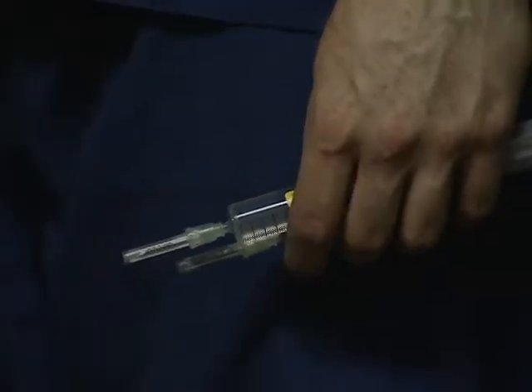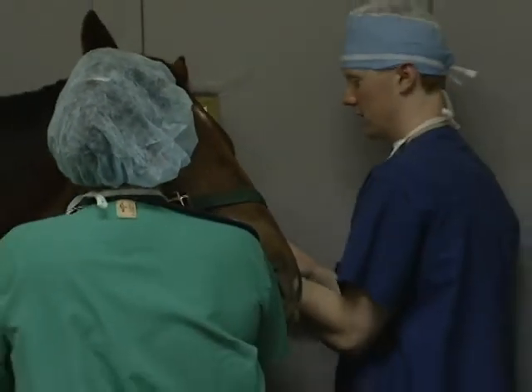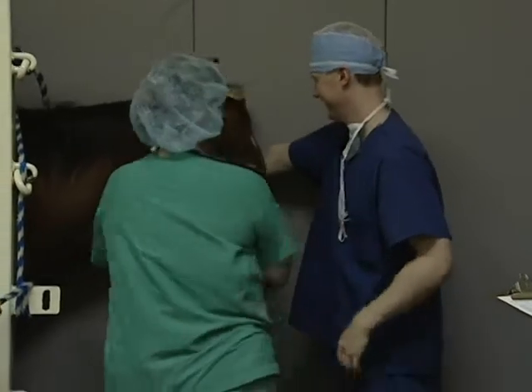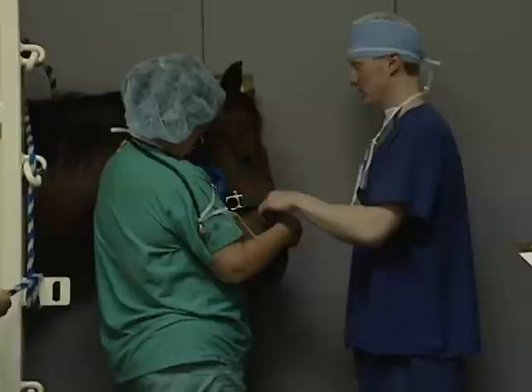All right, now they're going to give him the induction anesthetics, and that's going to cause the horse to go to sleep, and he'll slowly ease down and just slide down against that wall.